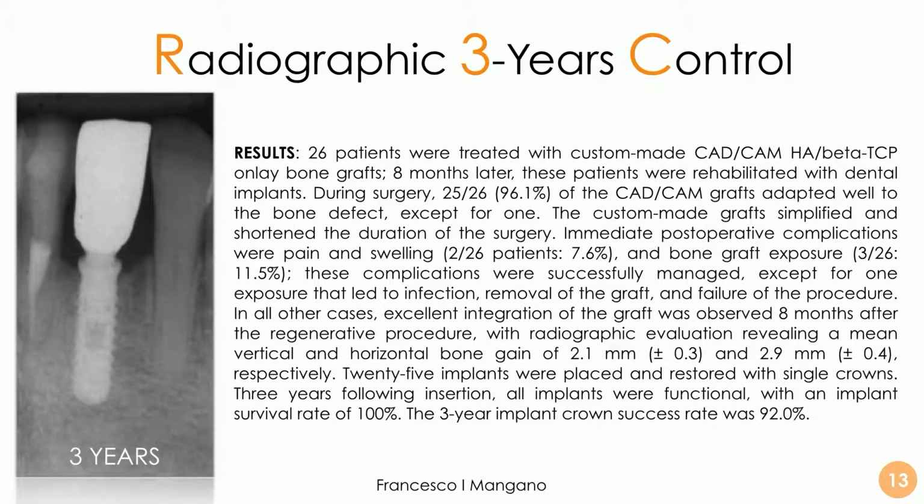I have to say that only few patients experienced post-operative complication. The most important complication in this case is bone graft exposure. It happened only in 3 over 26 patients. I have to say that it's about 10%. It's quite a high percentage, but this is the case for all the regenerative procedures with onlay. It's normal.